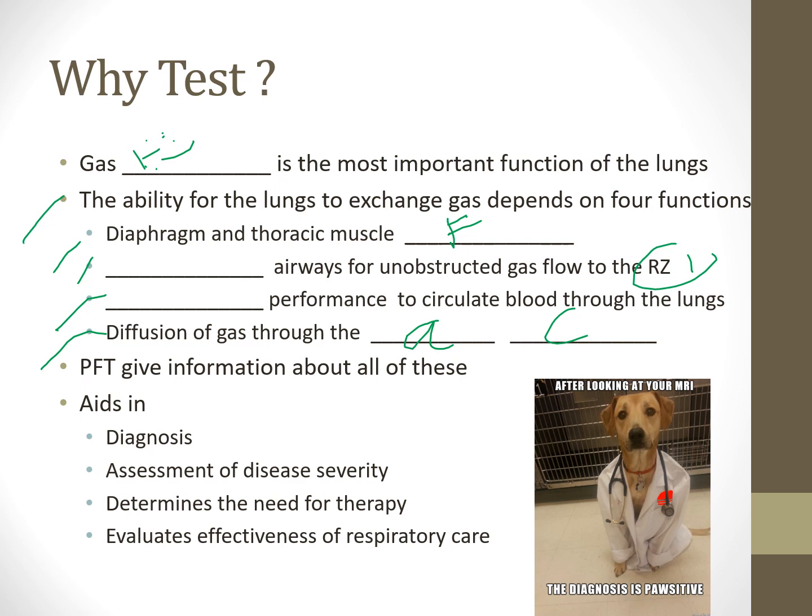And I'm going to measure how much carbon monoxide you inhaled, which we know, and then how much carbon monoxide is exhaled, and we'll subtract the difference. This tells us how easy it is for gas to diffuse into your bloodstream, because do you not remember, carbon monoxide diffuses over 200 times more into the bloodstream to the hemoglobin molecule than oxygen does. So this tells us about the thickness of the AC membrane, how hard or easy it is to get oxygen from the alveoli into the capillary. Well, the thicker the membrane, if we get a really, really thick membrane here, well, there's going to be less carbon monoxide that can make it into the bloodstream. And that diffusion is going to be very poor.